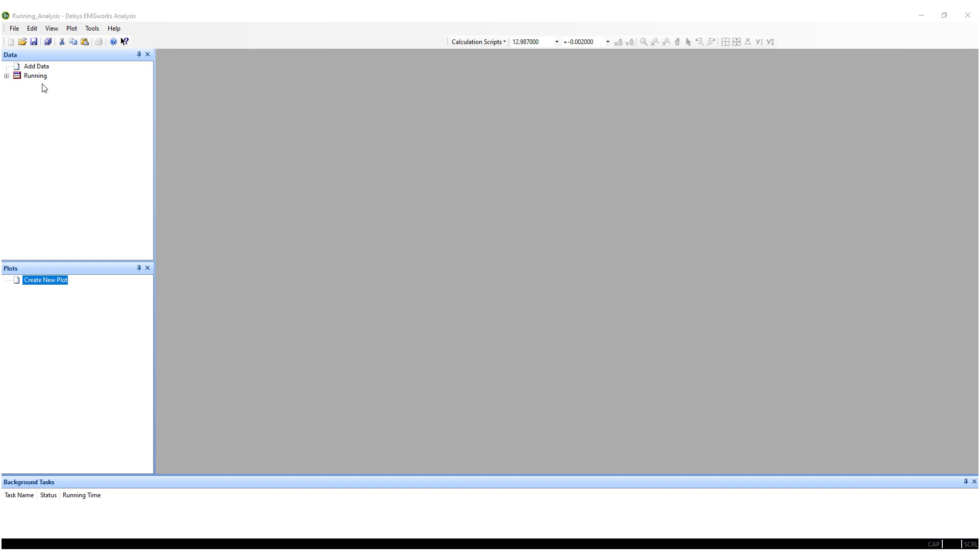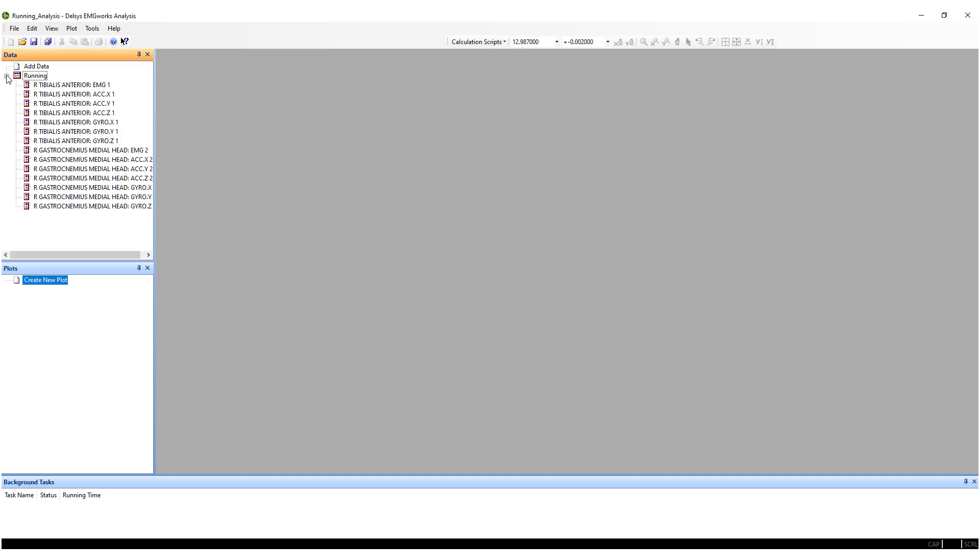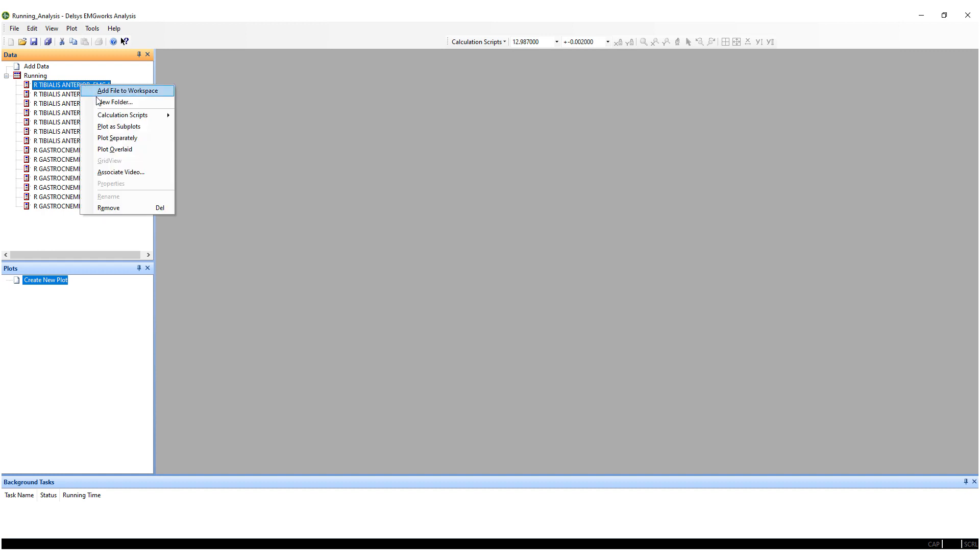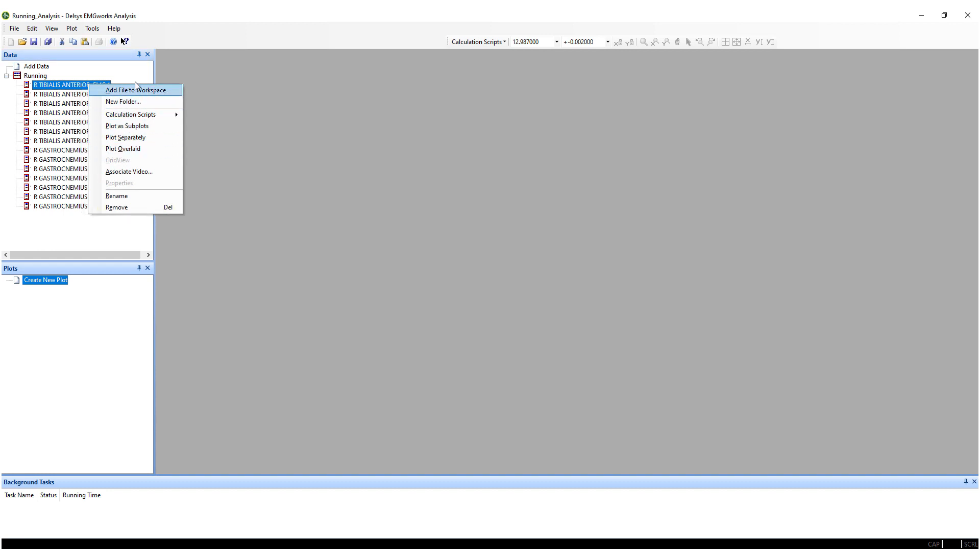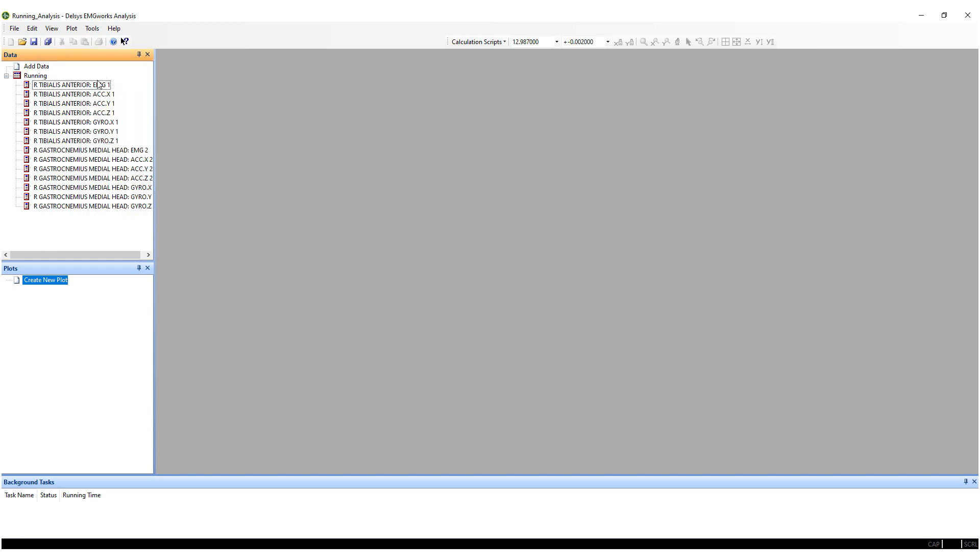To plot an individual channel of data, expand the data file and select the series you would like to plot. Right-click and select the appropriate plot setting. Multiple channels can be plotted by pressing Control and selecting each data series.